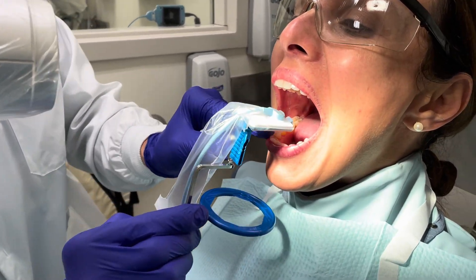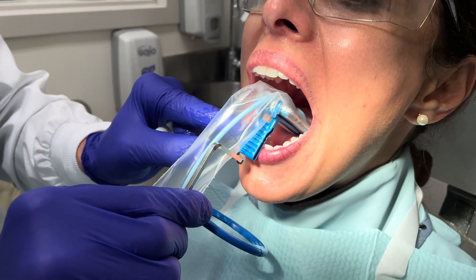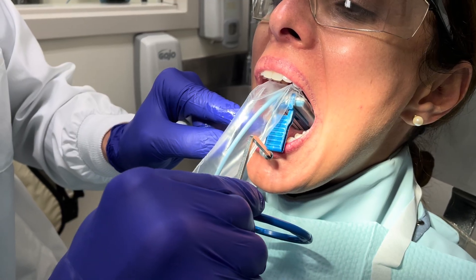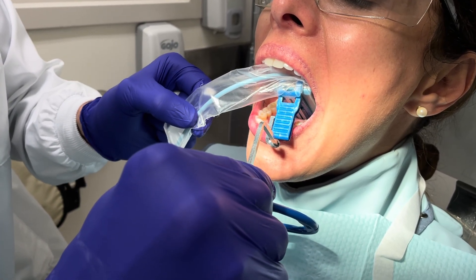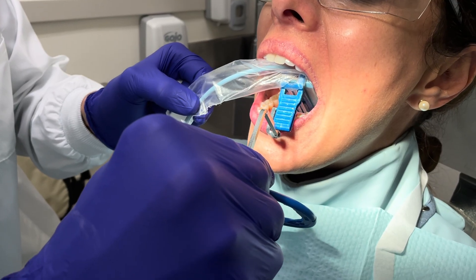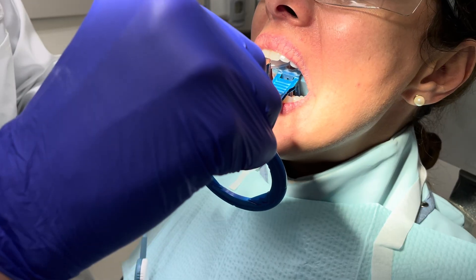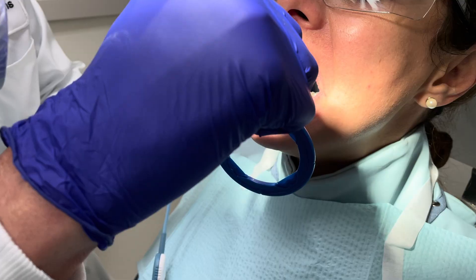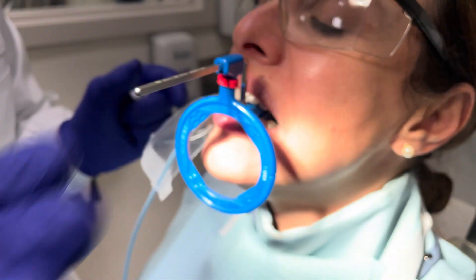We're going to come in just like we did, straight in, tilting. At this point, I'm not going to have her close. We're going to rotate it over to the canine. Now I can slowly move it down and back onto her tongue as she closes. Slowly close. A little bit more. Open slightly. Close all the way now. Perfect. Now we can line up.